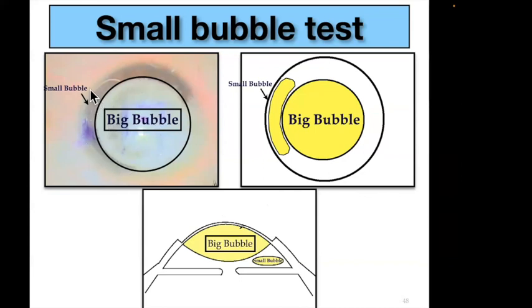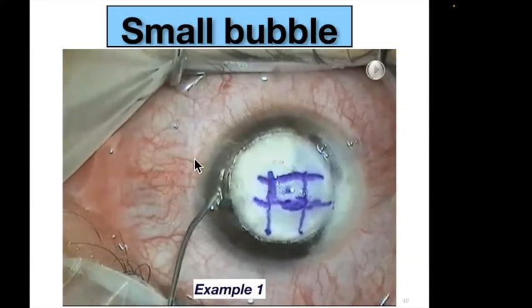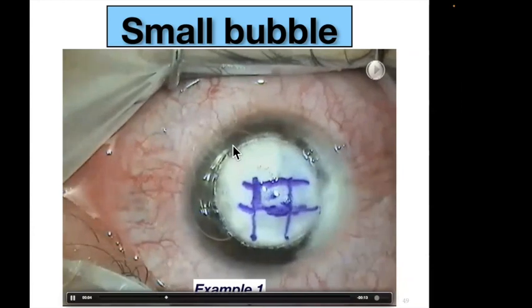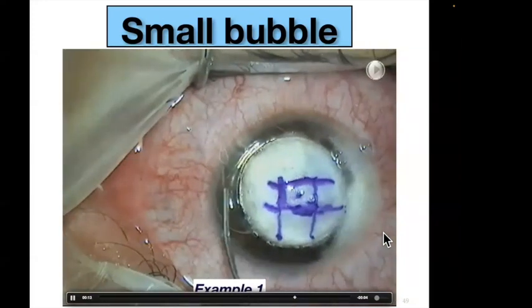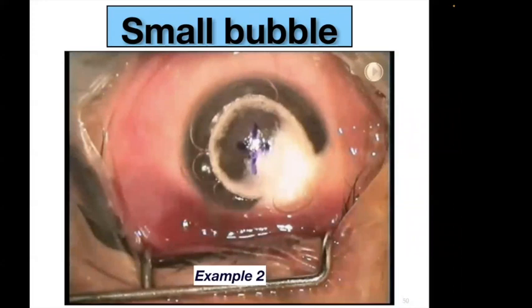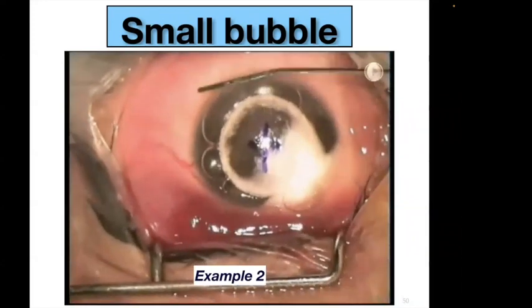But if you find this small bubble in the center, this means that you don't have a big bubble. So this is the small bubble test. Injecting air, you will find the bubble is trapped in the periphery of the anterior chamber in a kidney-shaped configuration, because the center of the anterior chamber is occupied by the big bubble. Another example, you see these small bubbles in the periphery of the anterior chamber. We call it a positive small bubble test.